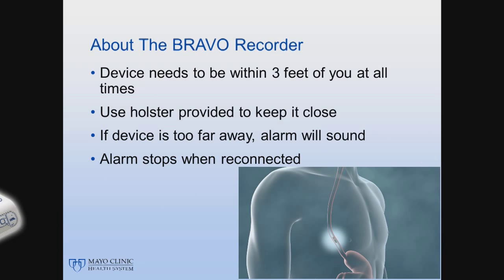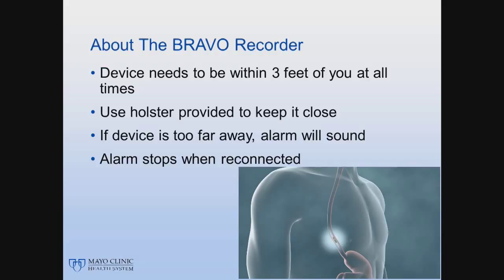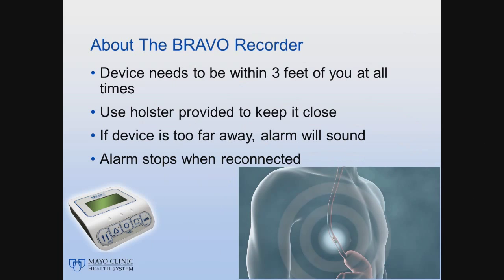If the recorder is too far from you, the signal may be disconnected. If this happens, the recorder will beep for 30 seconds and the number 1 will appear on the screen, letting you know that the signal has disconnected. To reconnect the signal, hold the monitor to your chest so the monitor can reconnect with the capsule again. The recorder will stop flashing and beeping once reconnected.